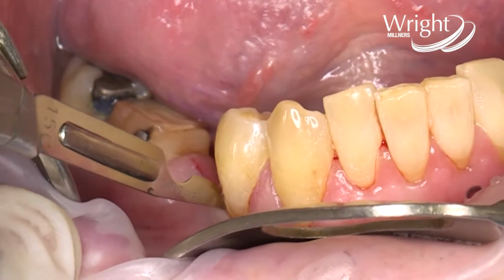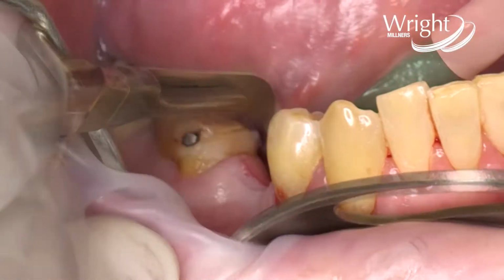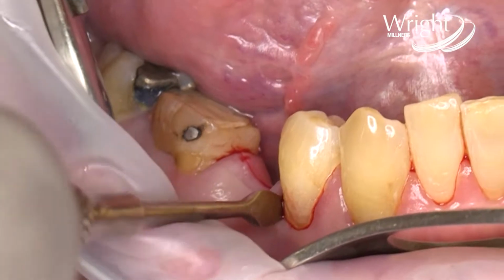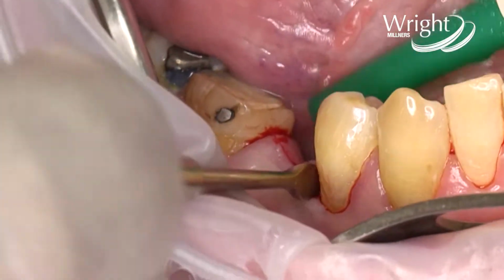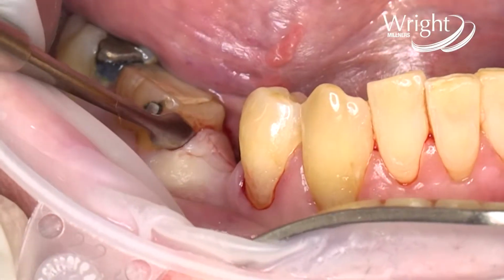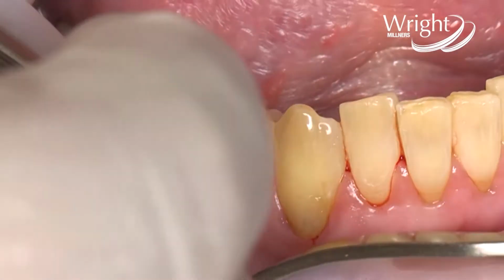Once we've done the incisions, we start reflecting from the line angles, and we go down to bone and just reflect gently, easily and distally. Once we've done that, we take tissue holding forceps, we grab the tissue with it, and we gently reflect, not applying force. Always holding the tissue and then reflecting.